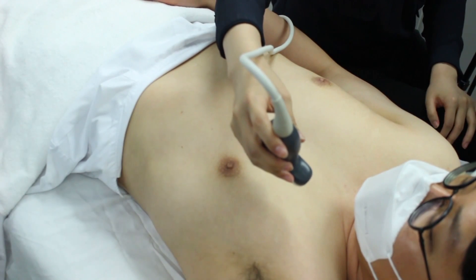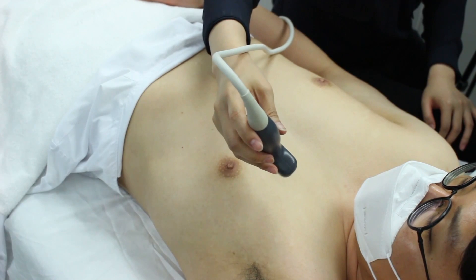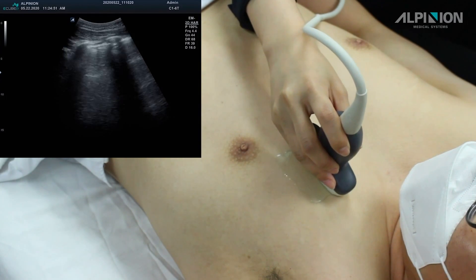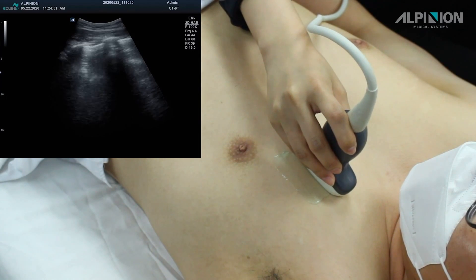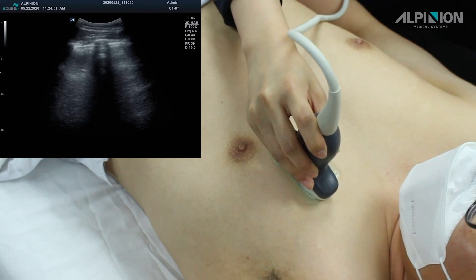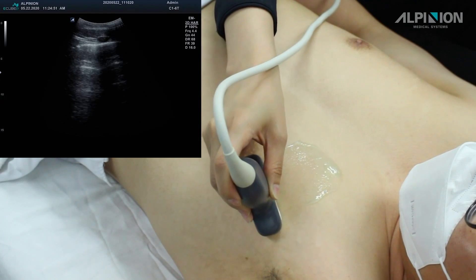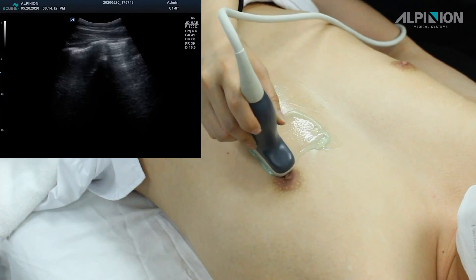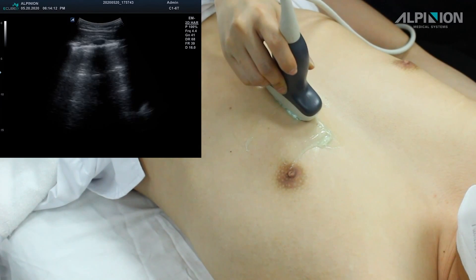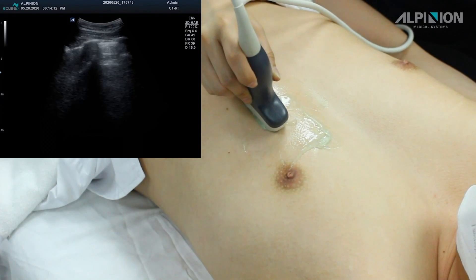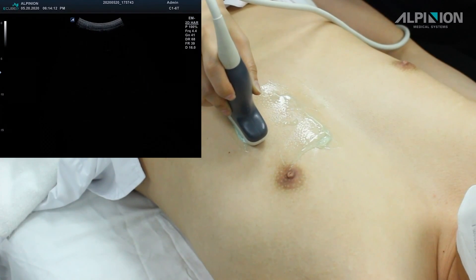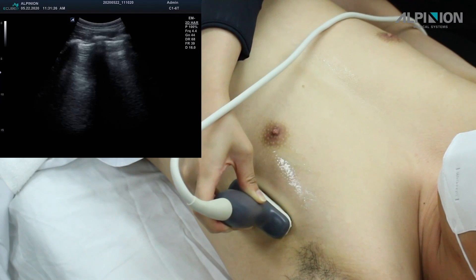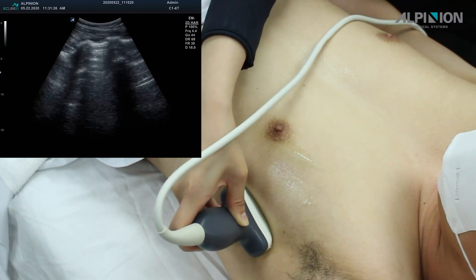Before we begin, make sure that your patient lifts his arm, and then place your transducer on his body. We are going to start from section 1. You need to find your pleural line and the ribs, and then slowly glide the transducer on his body in an S shape. Now we are going to move on to section 2, and then section 3. Don't forget to move your transducer in the shape of an S.